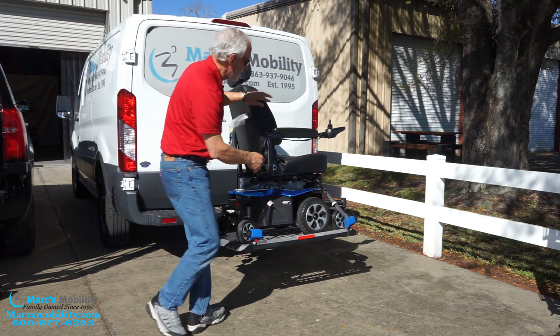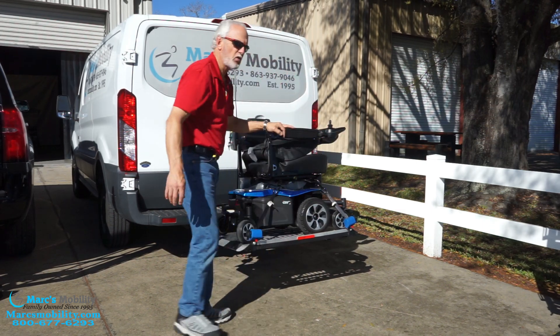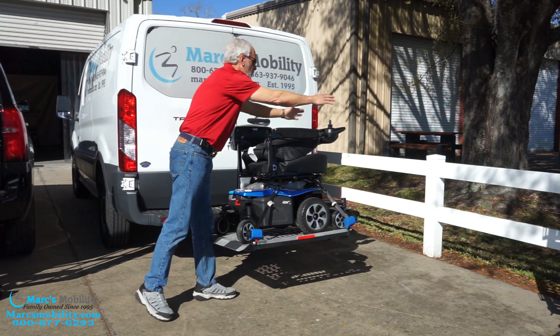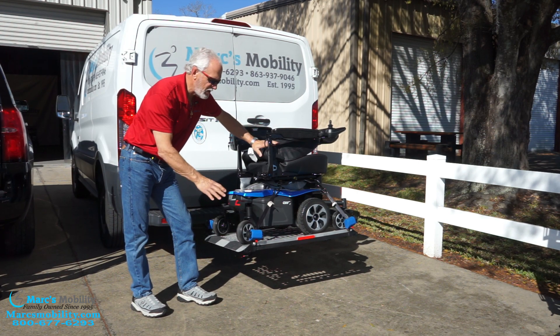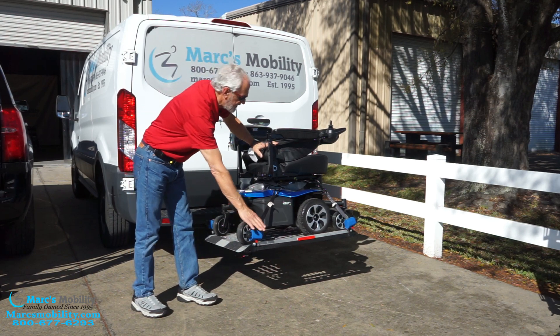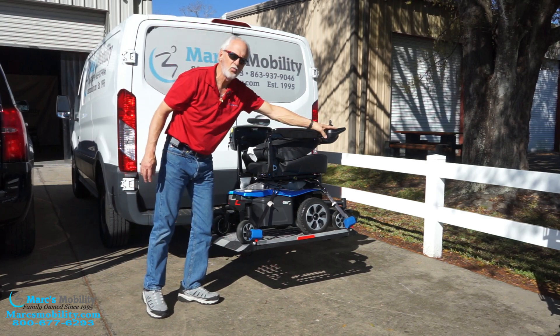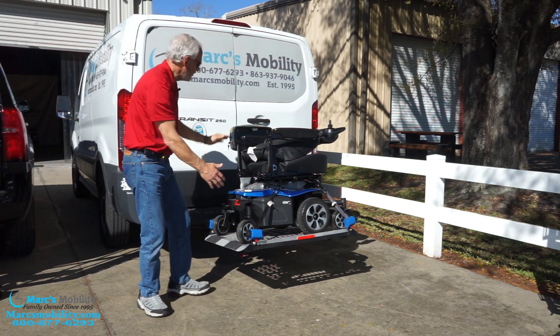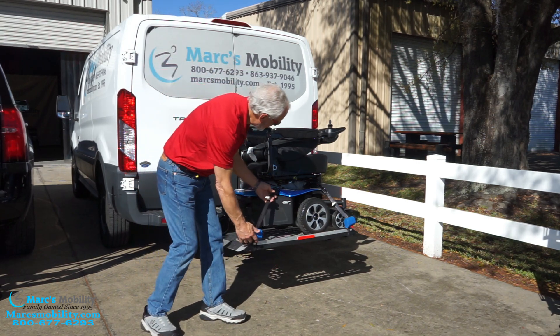If you put a chair on your lift, make sure the seat is down, make sure the power is off on your joystick, and make sure you have a cover. Always make sure you have a cover if you buy one of these lifts. You don't want the rain coming off your vehicle finding its way into your electronics. Make sure you have a cover over your chair — you don't have to cover the box, but cover the chair.